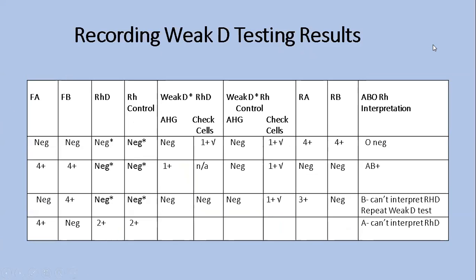So here I have an example of some different results from weak D testing, which I'd like to review with you, and hopefully it's going to make sense why we did certain things and what they mean. So let's look at patient number 1 here.